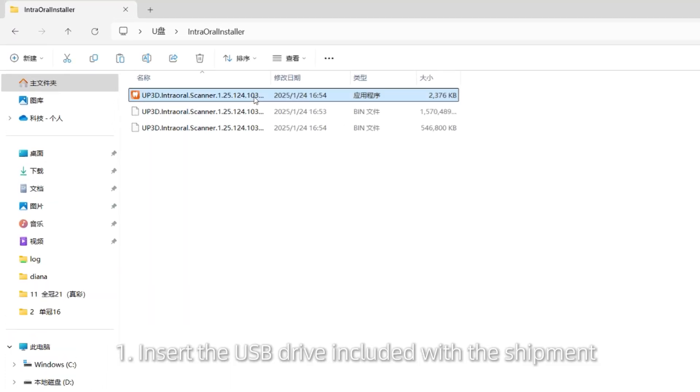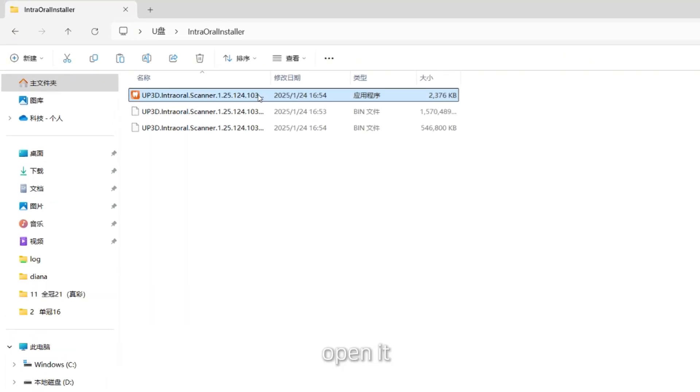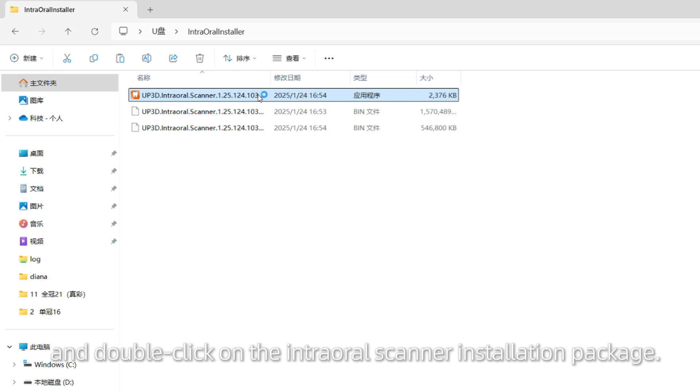Insert the USB drive included with the shipment, open it, and double-click on the intraoral scanner installation package.